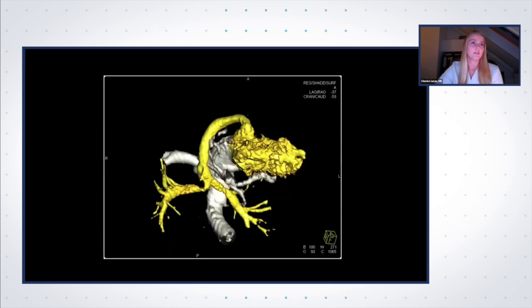360 degree. In this case, you can see that the stenosis of the Sano to PA connection only gets visible in a straight caudal angulation, and it is hidden in any kind of standard projection, which of course explains why previous biplane angiographies could not identify the hemodynamic problem.